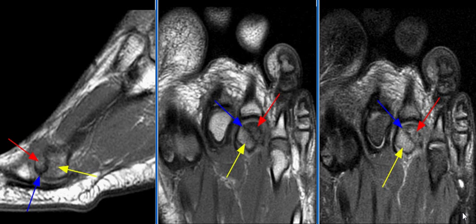This is a 25-year-old patient with history of dislocation of the third toe, who complained of left foot pain. MRI examination of the left foot was performed. There is osteosclerosis in the third metatarsal head with linear sclerosis along the margins of the distal ischemic change, compatible with osteochondrosis of the metatarsal head, also known as Freiberg's infarction.